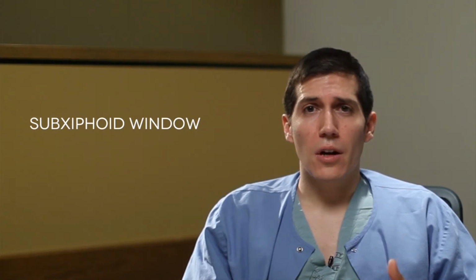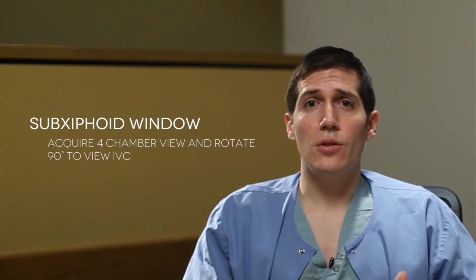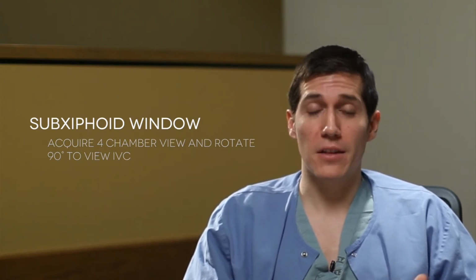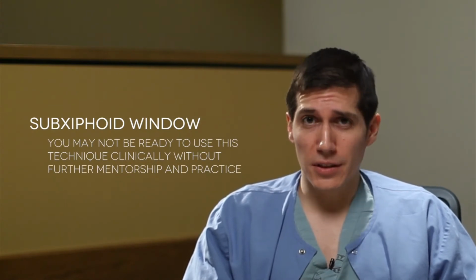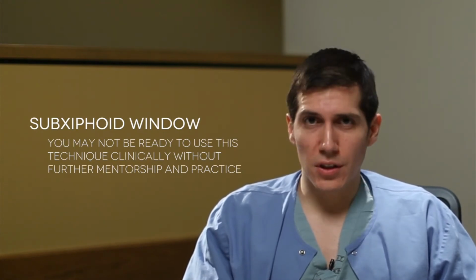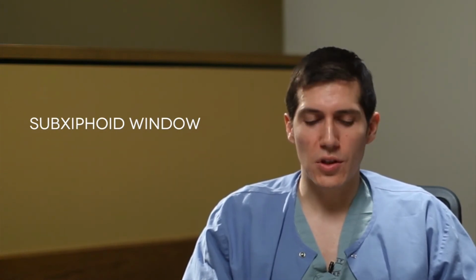Let's summarize what we've just done with the subxyphoid window. You've learned how to acquire the subxyphoid 4-chamber view and then rotate to an IVC or inferior vena cava view for volume assessment in the context of right ventricle and left ventricle function and size. So remember, although we've practiced this well just now, you may not be ready to use this clinically immediately. You need to practice as much as possible and have someone who is skilled in these techniques instruct you on the appropriate acquisition and interpretation of these images.